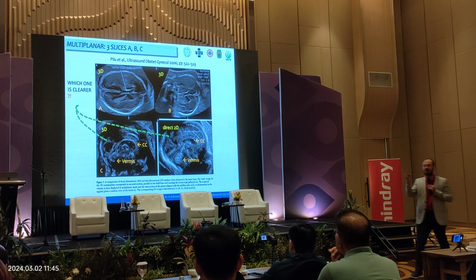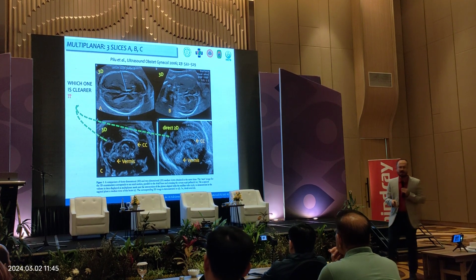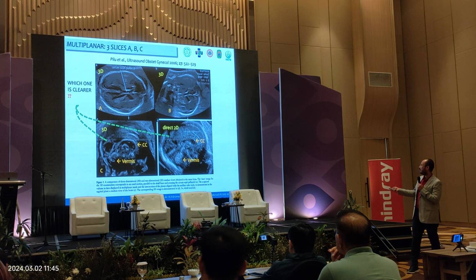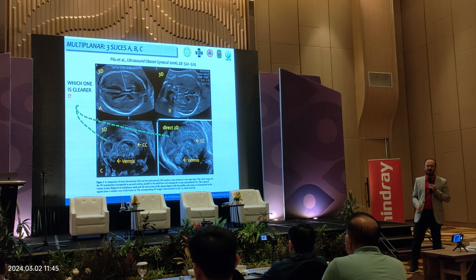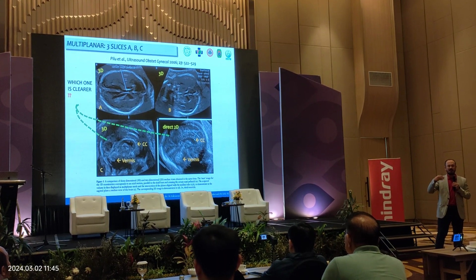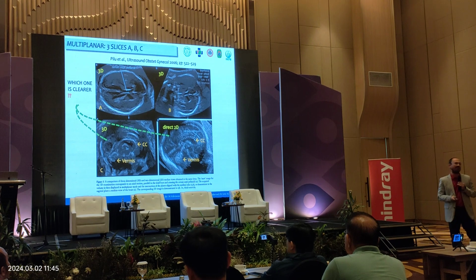So what Prof. Leonard Poon has told us, and Professor Wu Xing Xing also, is to use transvaginal often from now. So we can see morphologically, anatomically it is very clear compared to the three-dimensional using a transvaginal. But we don't know, the machine technology is getting higher and higher, and everything becomes almost comparable.